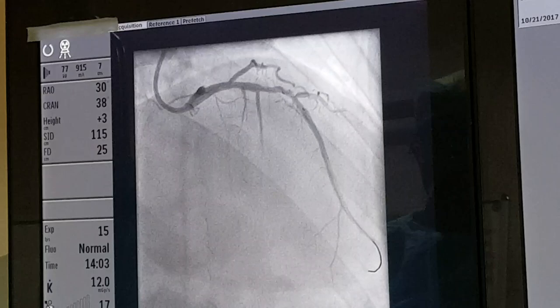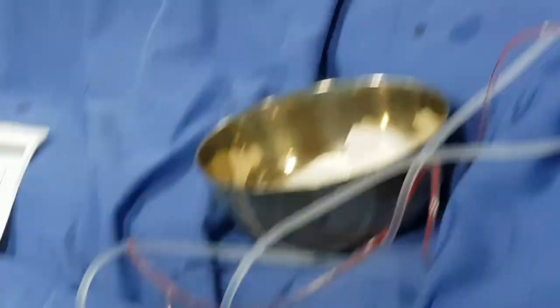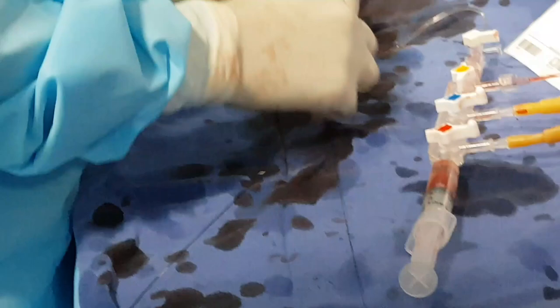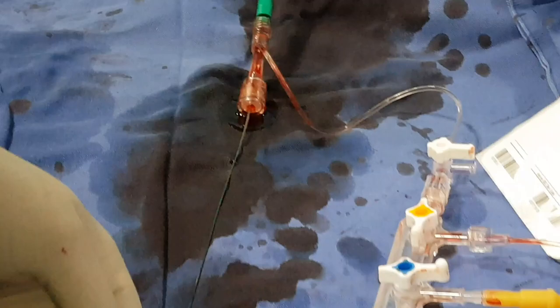Now what we will do is remove the balloon from the guiding catheter and then do some measurements to decide about the stent diameter, length, etc. I am removing the balloon now from the guiding catheter. The balloon has come out, and I remove it and wipe the wire.